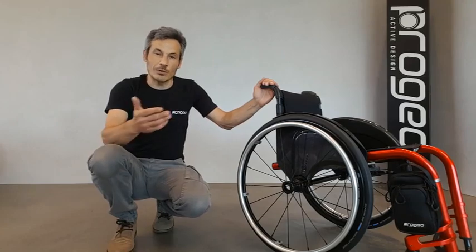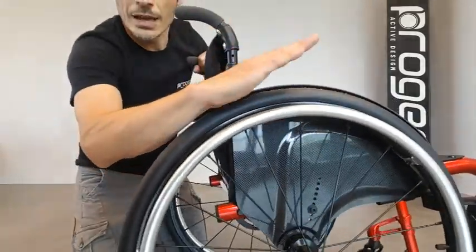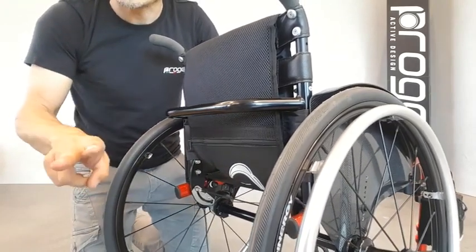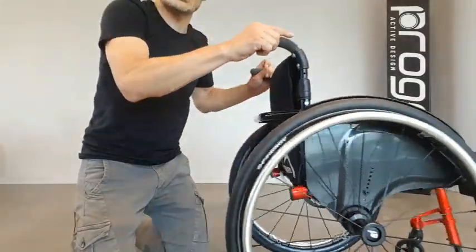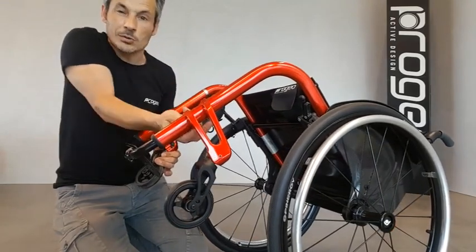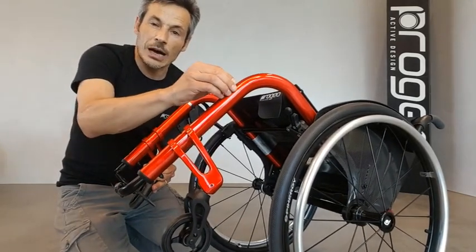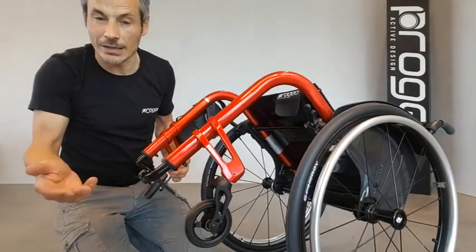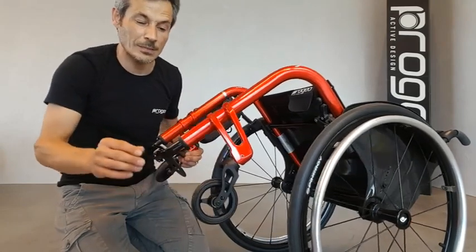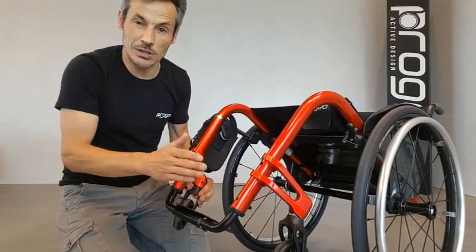Other adjustments for this model include those on the backrest. The backrest is height adjustable and angle adjustable. These two bolts on the plate allow for 20 degrees of angle adjustment. Regarding the front height, we have a fork support with a sliding system. Two bolts fix the clamp, and once you loosen them you are able to slide it upward or downward to the desired height. The fork support includes a very easy angle adjustment system, and the foot plates adjust in height, inclination and position as well.